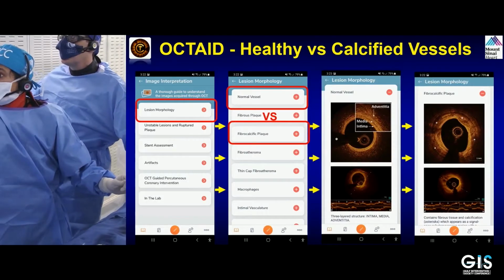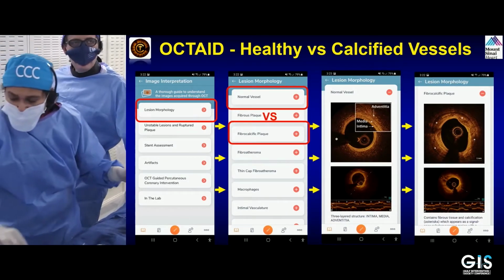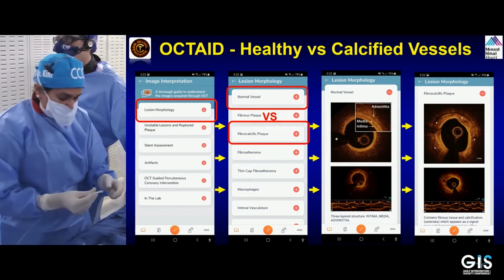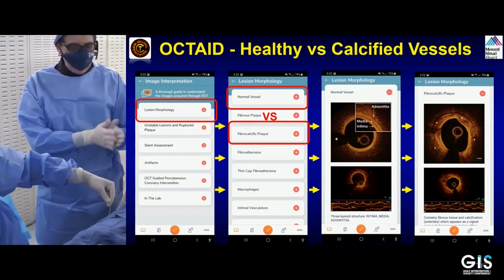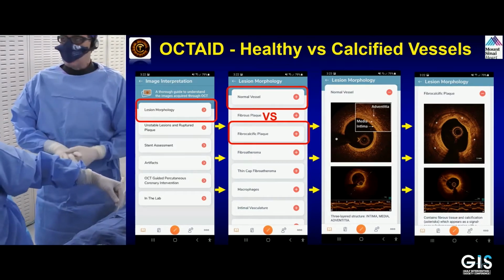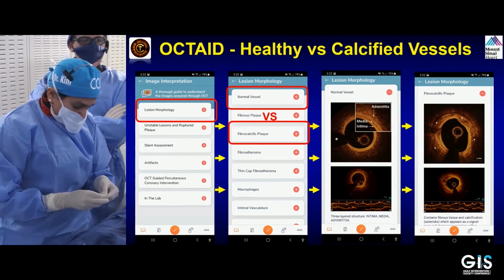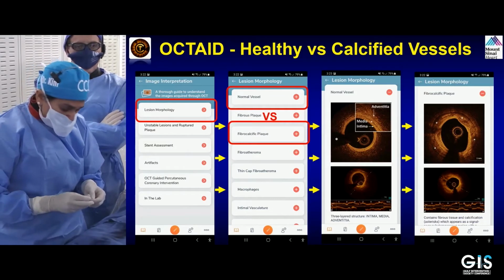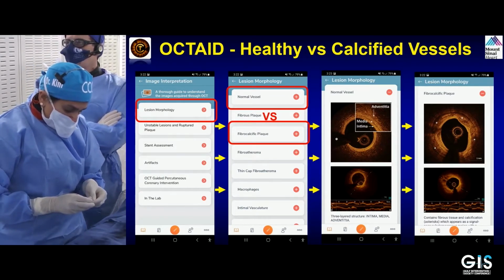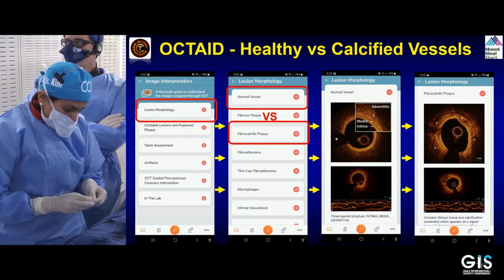Yeah, so it's step by step because in all honesty, we all are a little uneasy about the shades of orange. But this is made very simple by this app, and obviously it's clearly understood that it's not the same as if you don't have the machine, of course. But sometimes people don't get something because they're not sure how to deal with it, and I think that the app helps with how to deal with this.